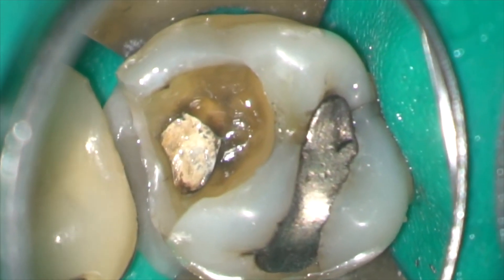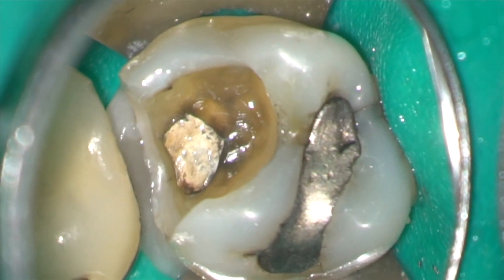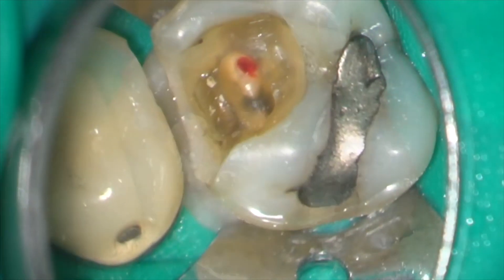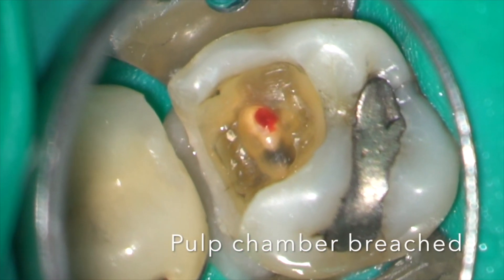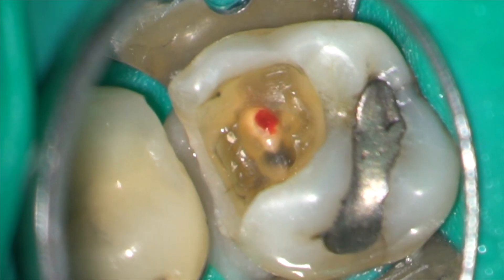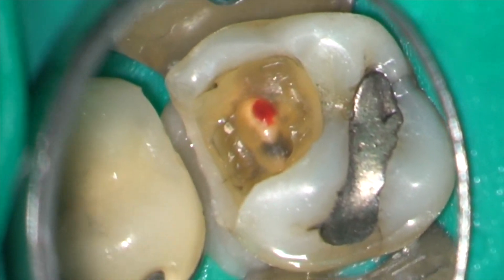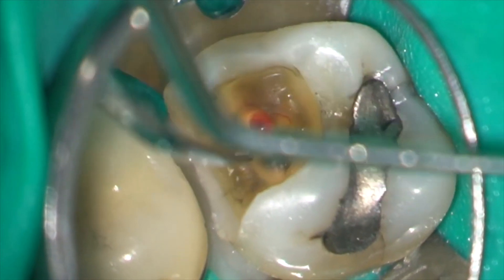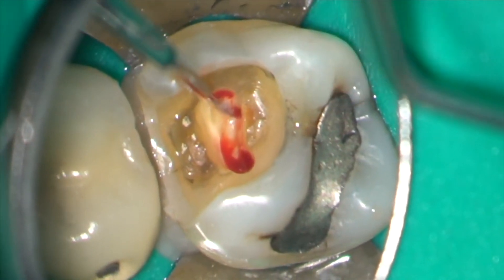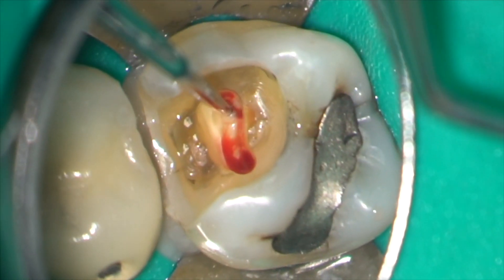At the base of the cavity you can see a liner that was placed under the amalgam. I've now used a long tapered diamond burr to penetrate the pulp chamber using that reference point and you can see bleeding from the inflamed pulp underneath. It's then a relatively simple matter to remove the roof of the pulp chamber using a non-end cutting burr such as the Endo Z.